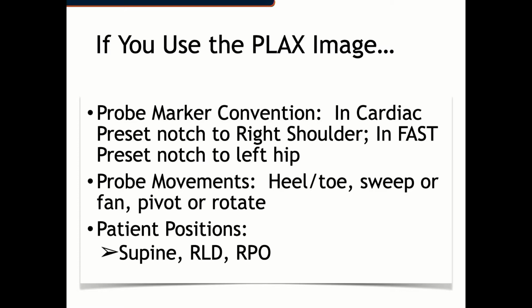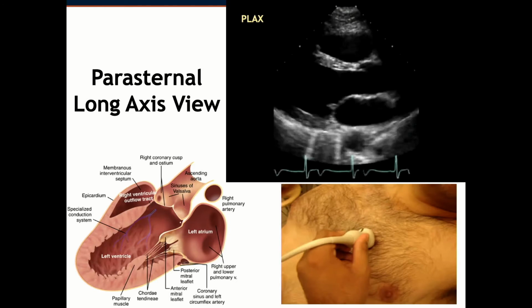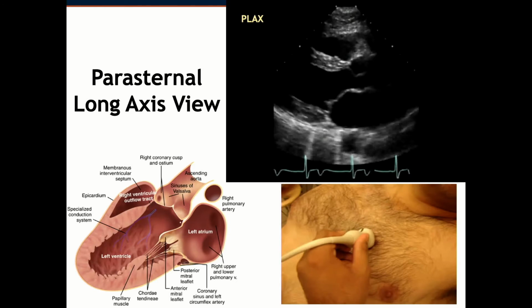And although you could change your patient position if your patient is able, again, remember these patients are often trauma patients, and so supine typically is how you're going to scan these patients. I'm going to begin my cardiac scanning at a parasternal long axis view.